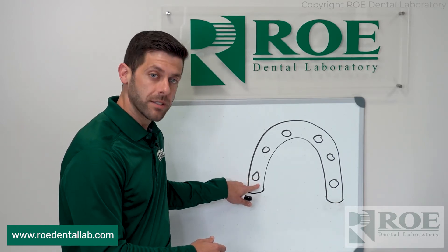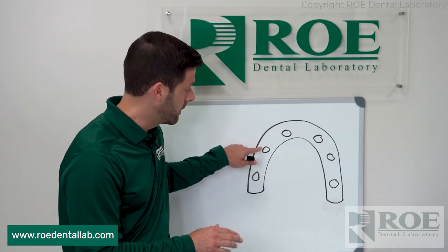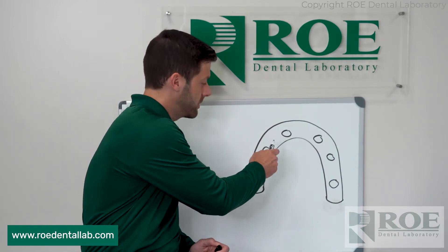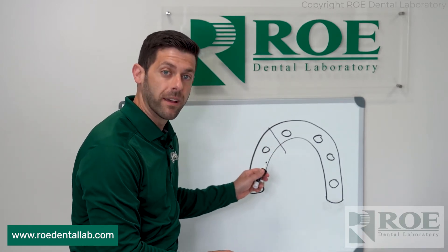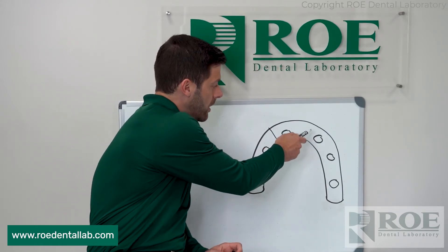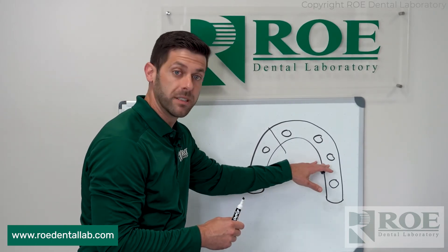Say we screwed in this site and we look and feel and push down. This site is engaged with the multi-unit abutment perfectly, and then you get to this one and there's a little bit of a gap. So what we do is we section the prosthetic right here. Now because we know these two are passive, we section this and want to see: is this seated all the way? Now this one's down, we go to this one — good to go. We go to this one and that one is also perfectly seating on the multi-unit.